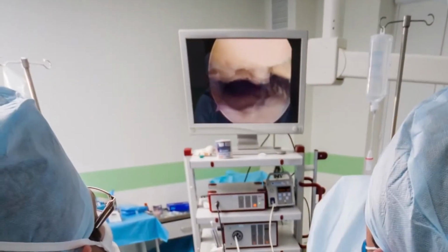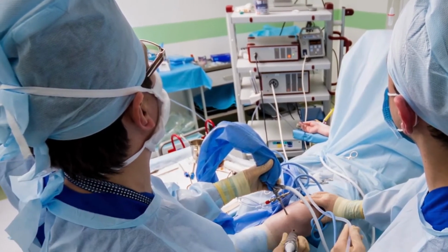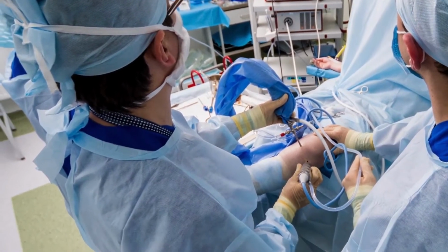Knee arthroscopy, also known as a knee scope, is an outpatient procedure done through 3 small incisions. Through the small incisions, I am able to insert a camera to directly see the structures of the knee joint. The camera is fixed inside a larger tube. Water flows around the camera inside the outer tube to fill up the knee joint. The fluid is held inside the capsule, resulting in increased pressure, which serves to decrease bleeding and to separate the knee structures for visualization. The first part of the knee scope is the diagnostic portion.